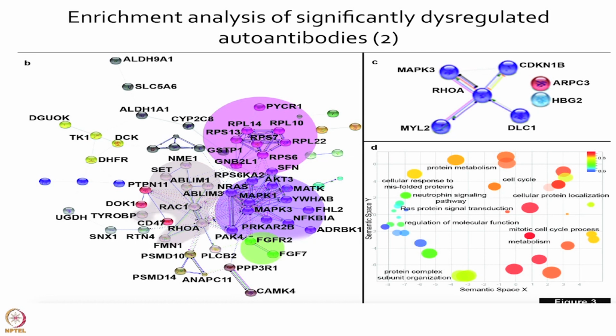Further, we tried to enrich these various candidates and looked at their interaction networks, and found that meningioma grade 1 gave us 4 distinct clusters of protein interactions, whereas grade 2 only gave us 1 cluster in the protein interaction network analysis. These are shown on the left side and the top right side. We have also utilized the GO terms emerging from healthy control versus meningioma grade 1 and tried to map these interaction networks in this figure which you see in the bottom panel.